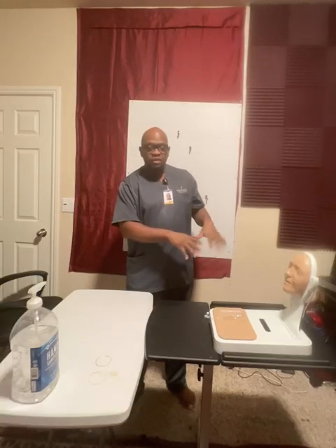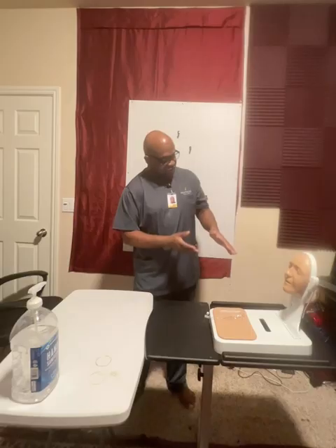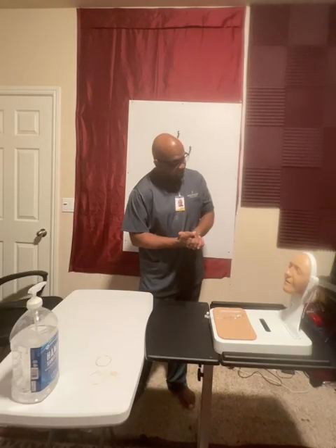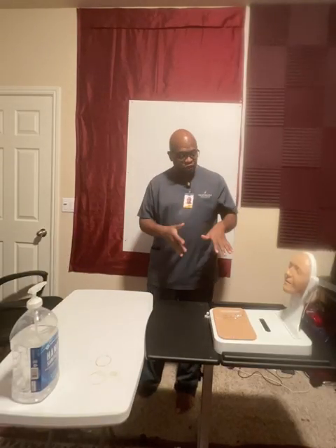Now, I'll make sure Mr. Jones is comfortable. I'll give him the call light and ask, is there anything that you need? Everything's good? Okay, please let us know if you have any questions. Then from there, before I leave, I'll do hand hygiene, go wash my hands, and I will then go document the procedure that just took place. Thank you very much.